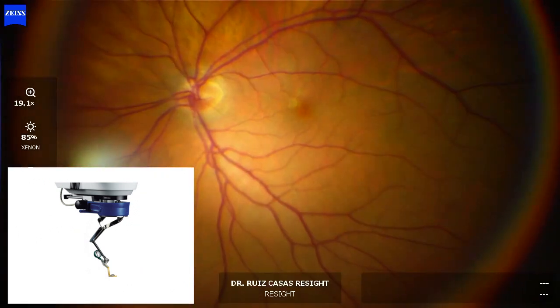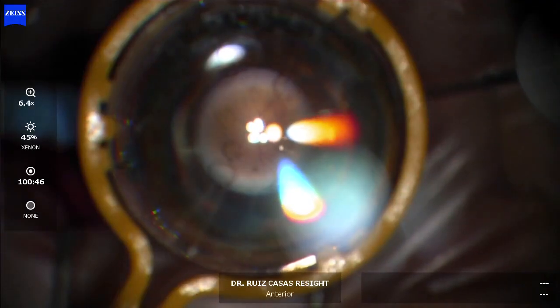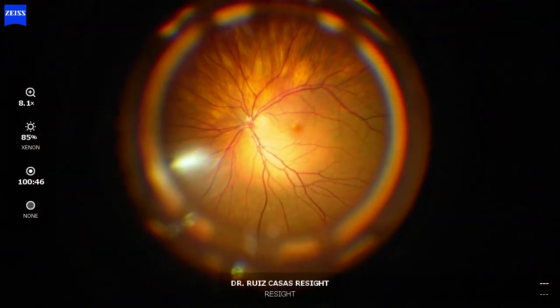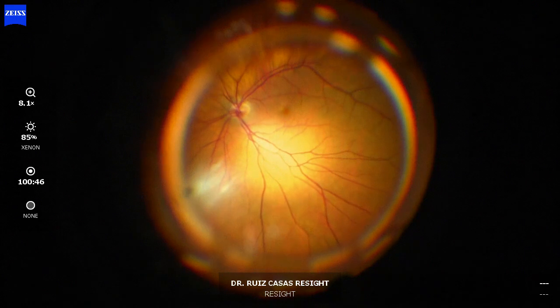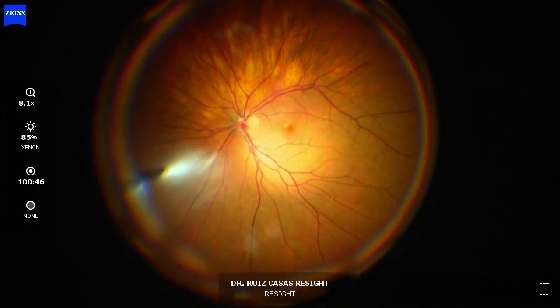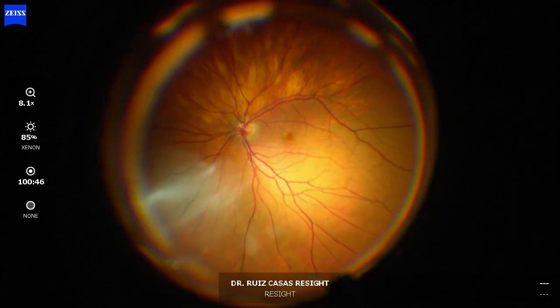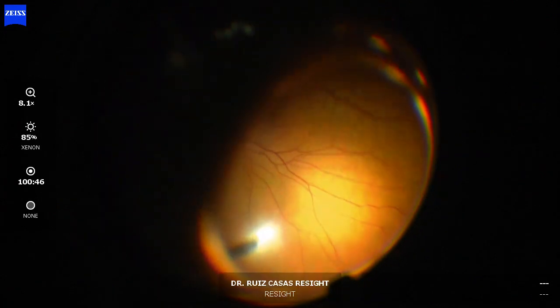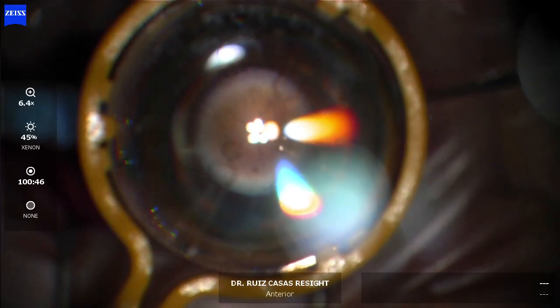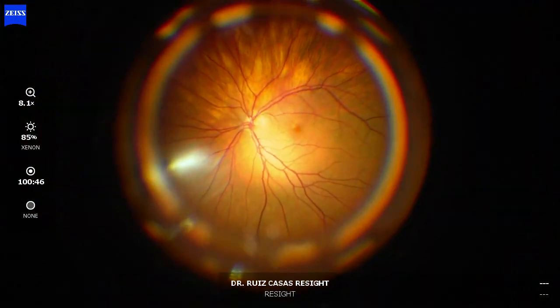With the normal yellow lens of the biome, you have a quite nice view of the macula and also a quite large peripheral view of the fundus, as you can see now. This normal yellow lens is excellent — you have a quite nice view of the macular area and also a quite nice peripheral view of the retina.